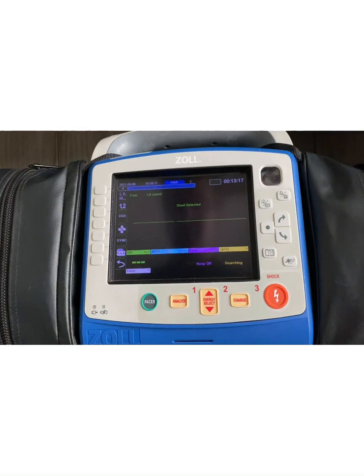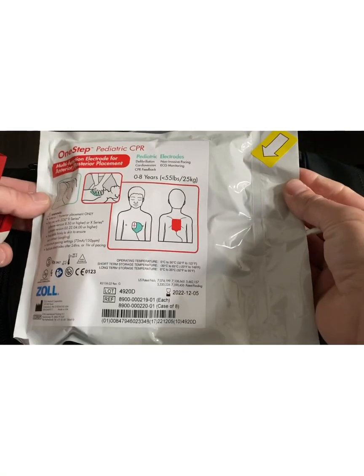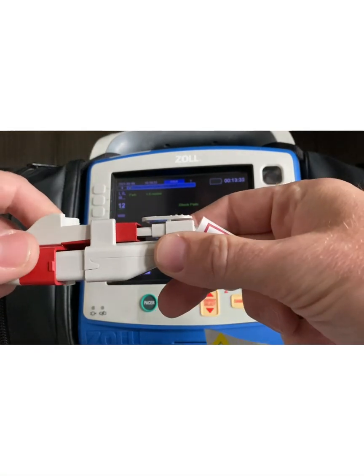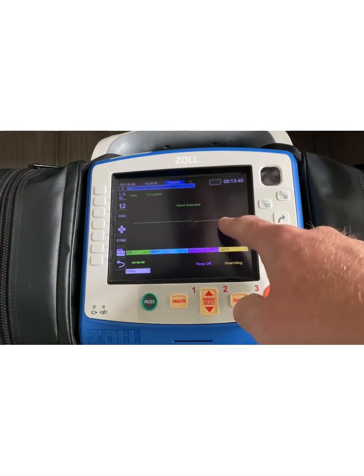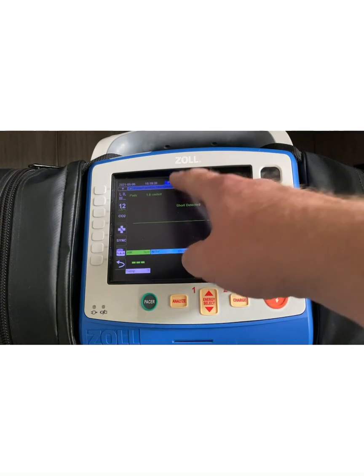This is also true for pediatric pads. One-step pediatric CPR pads have the same connection point we just looked at. They plug in directly, but they take it a step further. Short detected, asystolic rhythm — but in this case, it's switched to pediatric mode. So from a cardiac arrest perspective, it tries to manage as much as it can without you having to do much on the monitor.